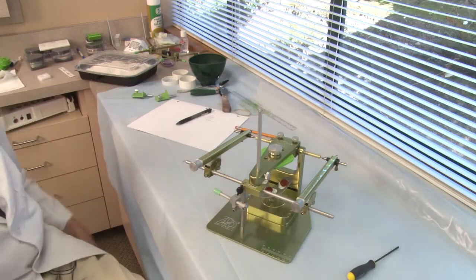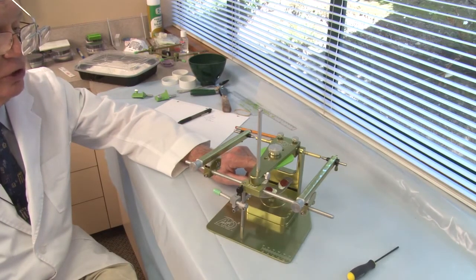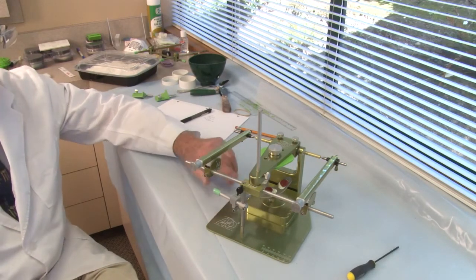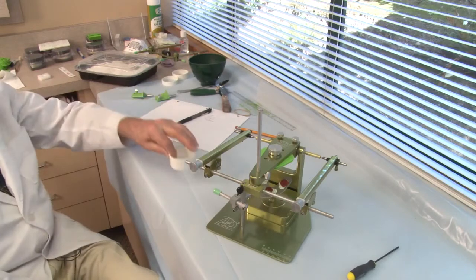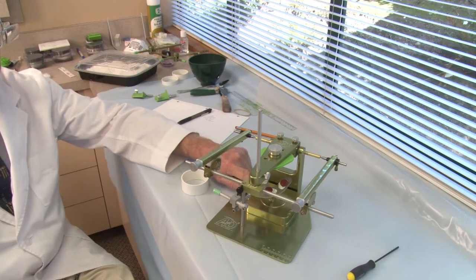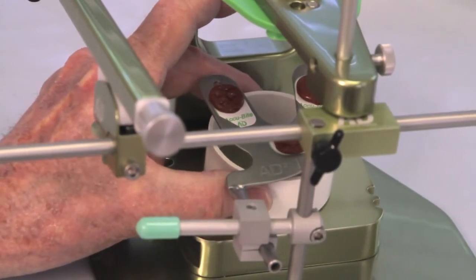Now the next thing I have to do is that you do not put a model on this bite fork, because if you put a model on, the weight of the plaster may cause the bite fork to be deflected slightly down. So you must support this bite fork before you put a model on it. And so we look at it and decide how much plaster I am going to have to build up from here to here to support this bite fork. And it looks like it's going to require the big ring here, the thickest ring.